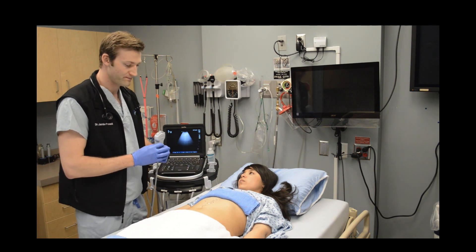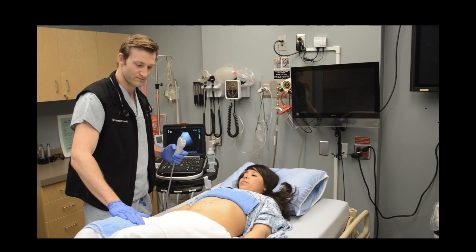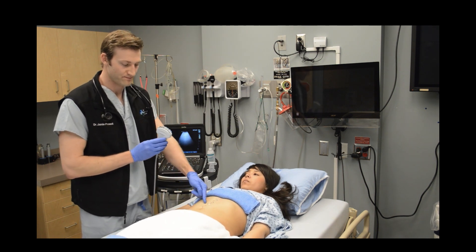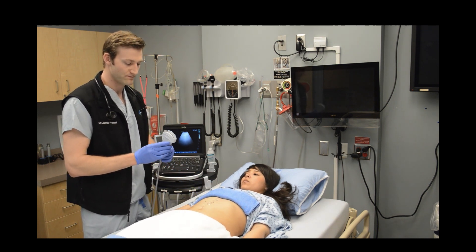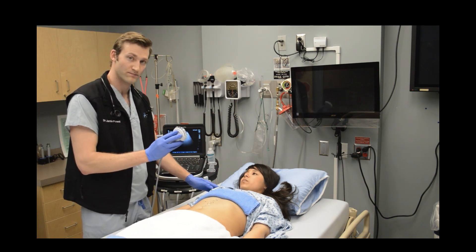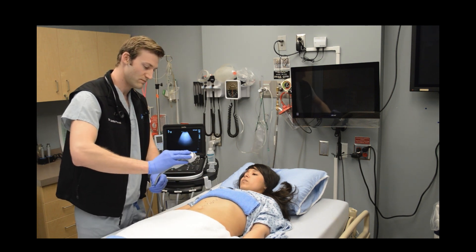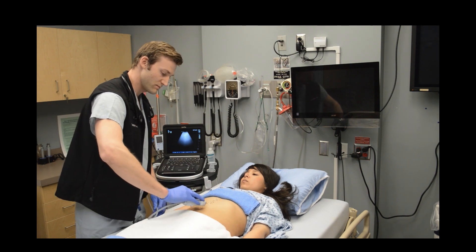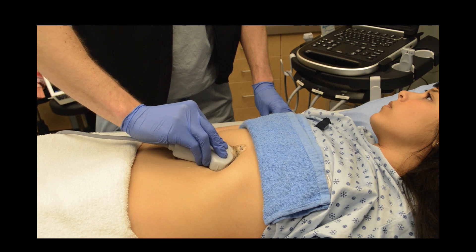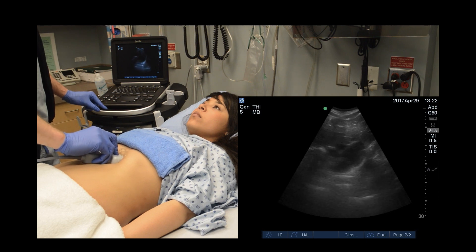Drape the patient appropriately in the supine position. If desired, have them flex their hips and knees to relax the abdomen. Use a generous amount of gel from the umbilicus to the xiphoid process. Use the transverse plane with the probe marker to the patient's right. You will want to start at maximal depth, and you will notice that your hand will be completely over the probe to allow it to lay flat on the abdomen. I am placing the probe just cephalad to the umbilicus, aiming almost straight up and sliding the probe cephalad until a window through the liver can be obtained. This prevents me from missing a massive pericardial effusion.